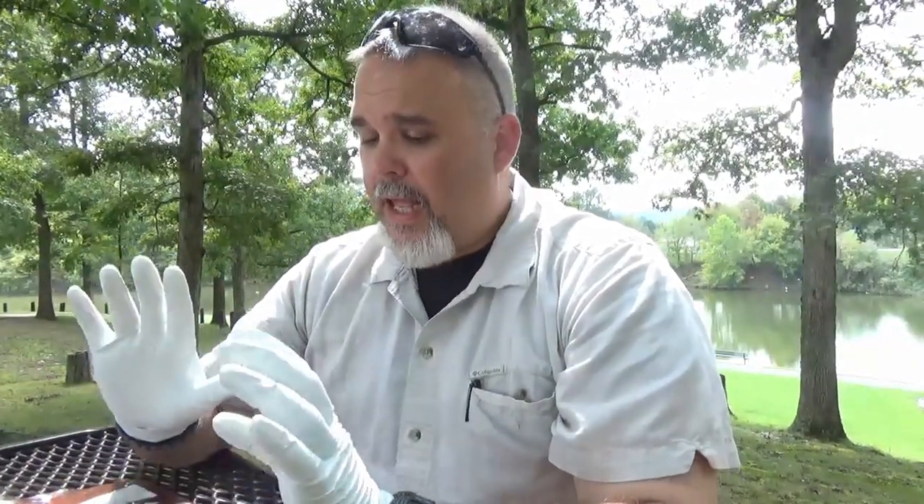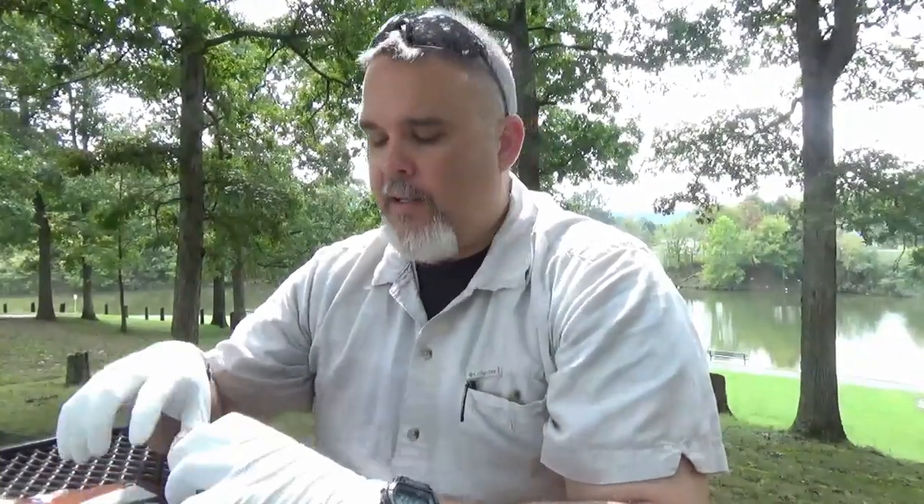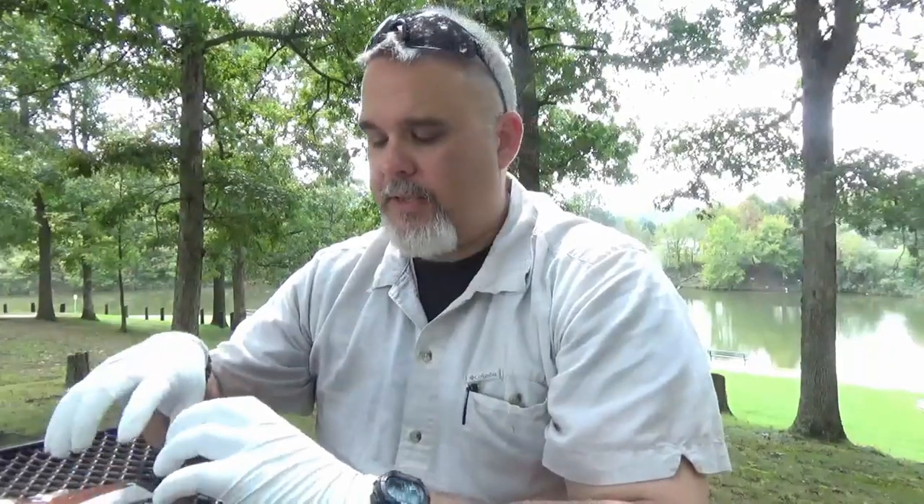Let's get to the meat of today's video — tension pneumothorax and needle chest decompression. I've got a demonstration here I'm going to show you that involves a balloon and a set of ribs. Tension pneumothorax is one of the three big killers in trauma: you've got massive bleeding, tension pneumothorax is number two, and then you've got airway obstruction. So this is something that if it's not treated quickly, can lead to death. It's a very important skill that you need to know and be comfortable with.